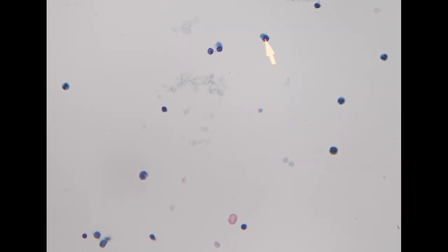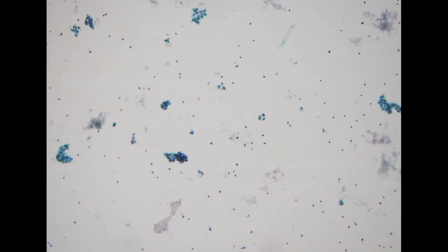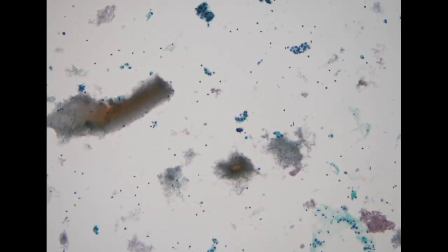However, in the background, you also see quite a lot of plasma cells and lymphocytes. So I feel it's better that we don't call it tumor right away, but we use the AUS category.